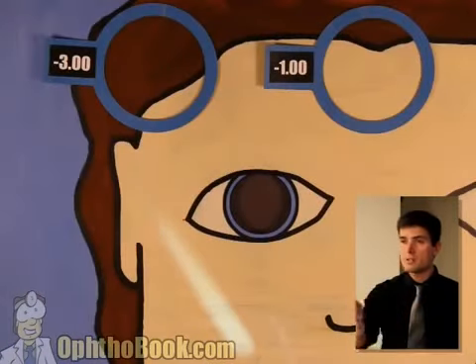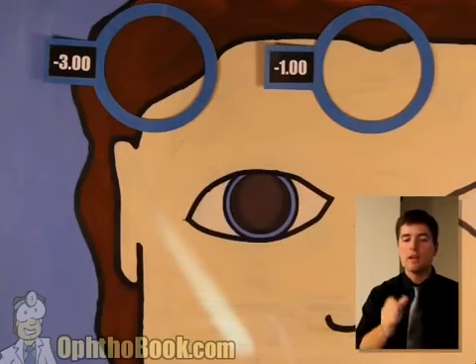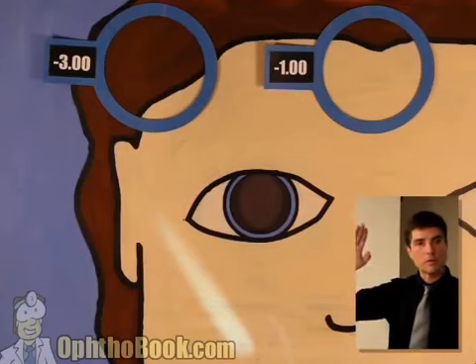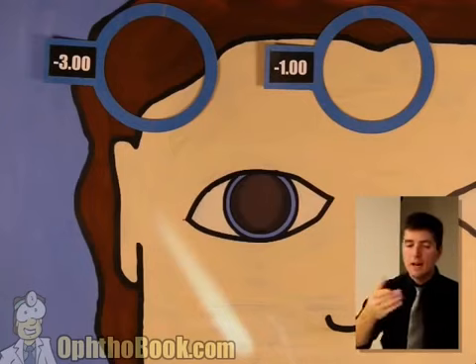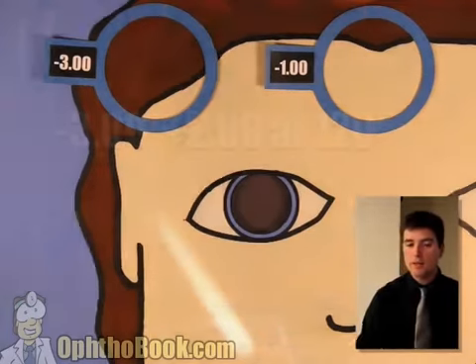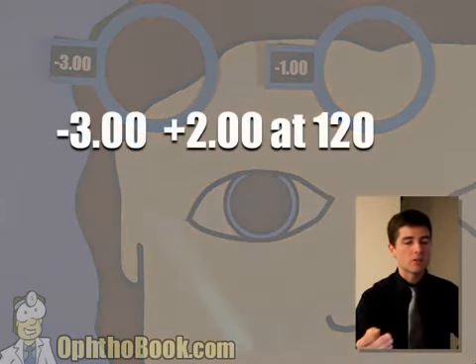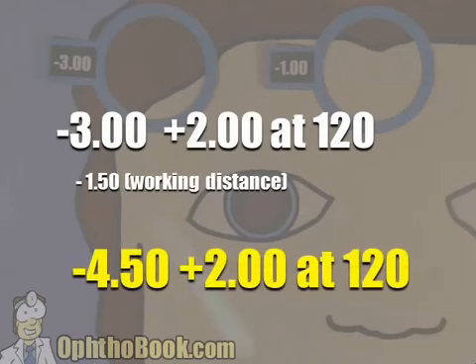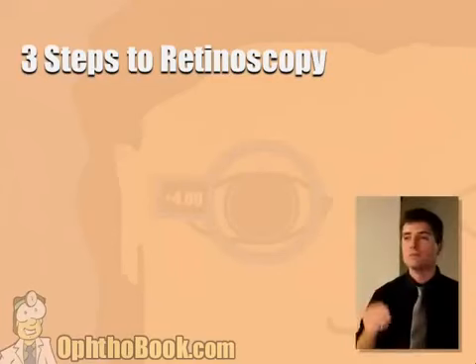Once again, we set our lenses aside, we look at it, this is a -3 plus 2, and you look at your axis, and if it's not obvious, you hold it in front of your phoropter and look at the angles on that thing. I'm going to estimate this is about a 120, and so we end up with a -3 plus 2 at 120. Last step, you subtract your working distance, and you end up with this prescription: -4.50 plus 2 at 120.